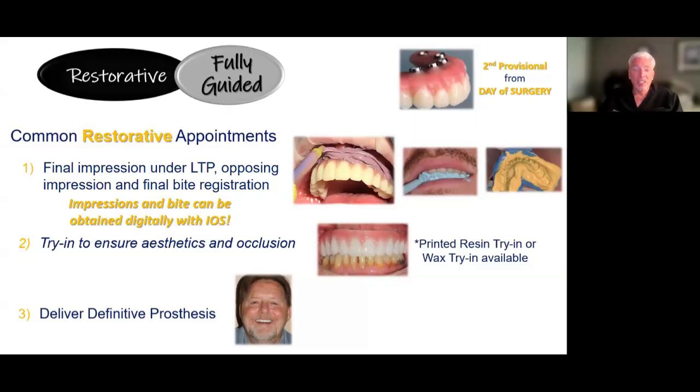Third appointment, we deliver the final prosthesis. Some people may skip that, and it's a two appointment, and you're delivering the final. That's up to you. Again, work that out with your laboratory.